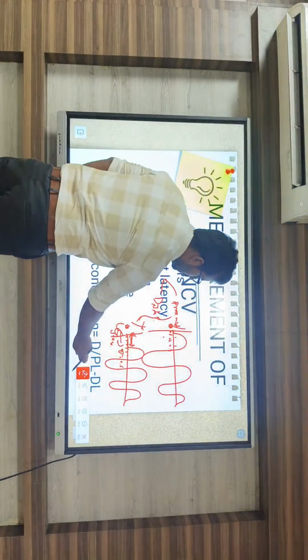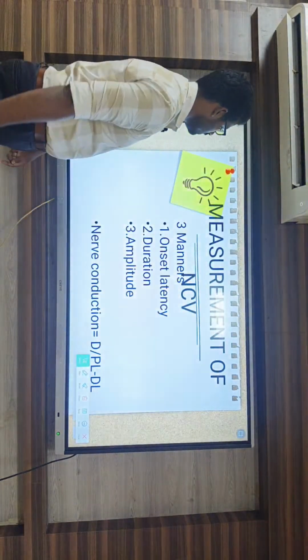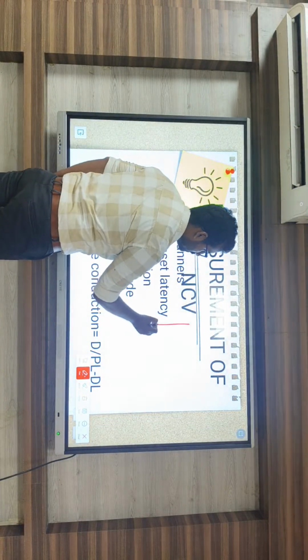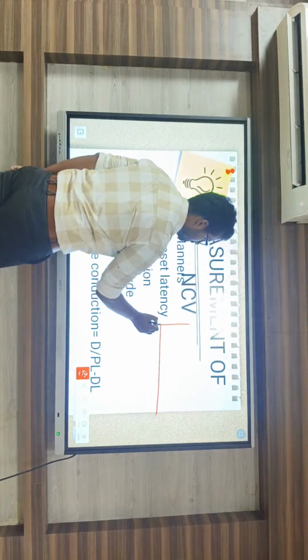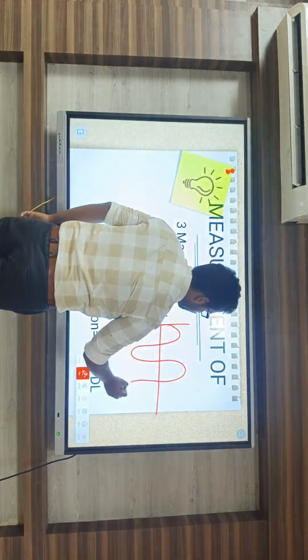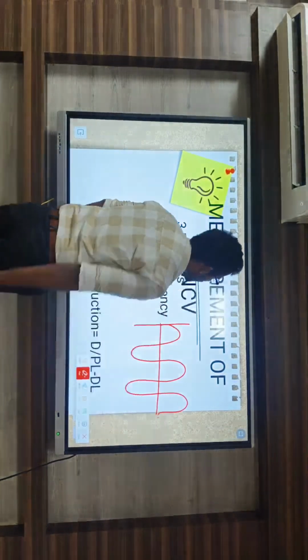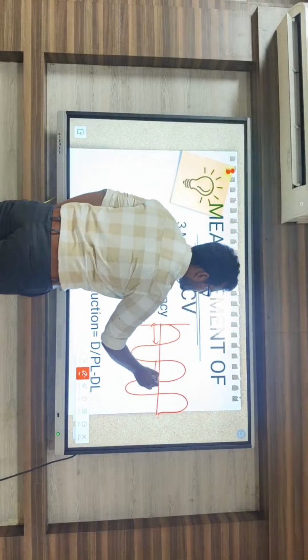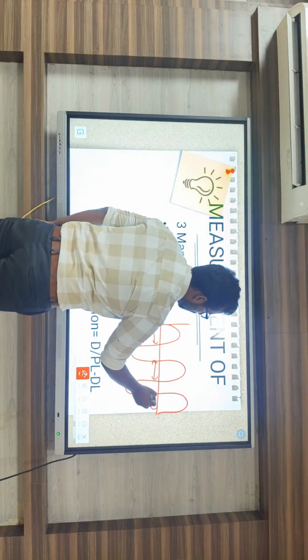So coming to the duration. So what is duration? So this is about the duration. The horizontal level is known as the duration.